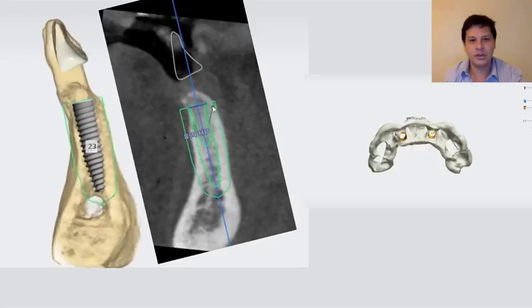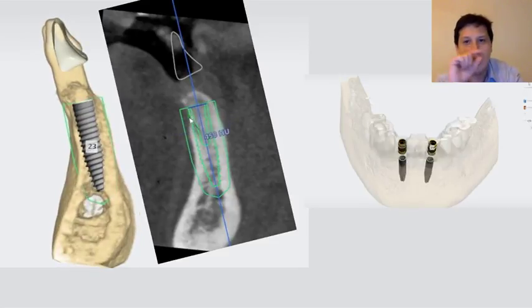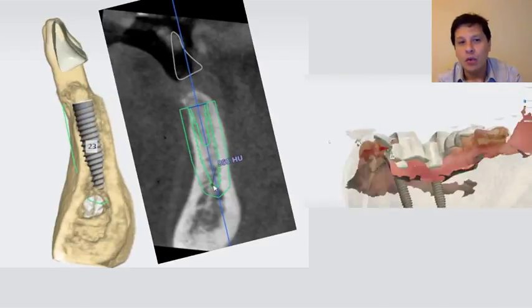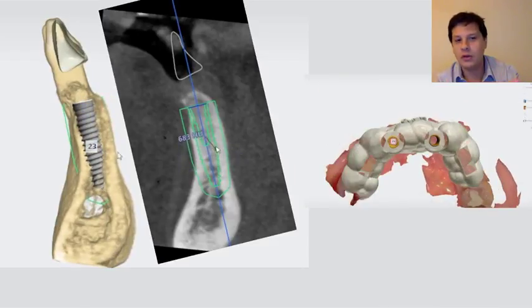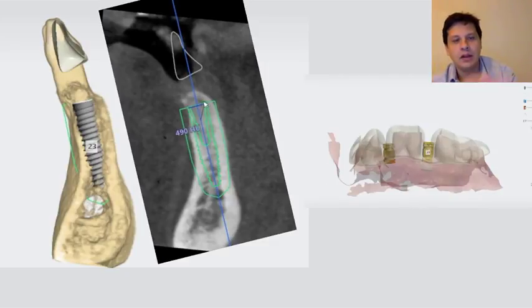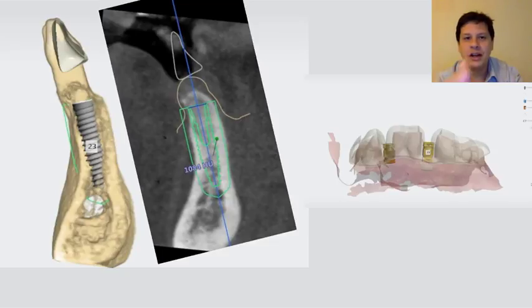and a provisional restoration. Now, you see here on the planning that this is a 2.9 situation. You only have about 3.5 millimeters. So the 2.9 implant, to be in a prosthodontic position, a screw-retained situation, only has one place to go. It's that situation over there. If you don't hit the drill on the first time, there's no room for angulation. So this is the planning.